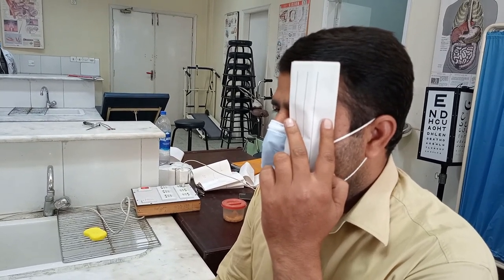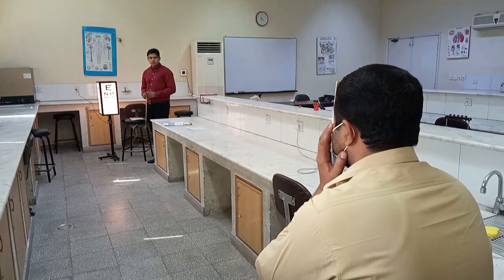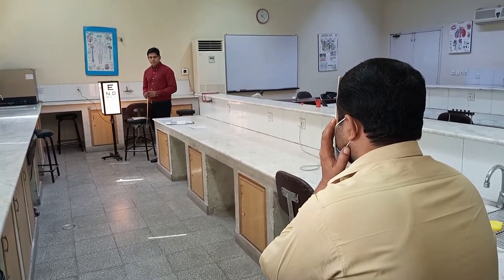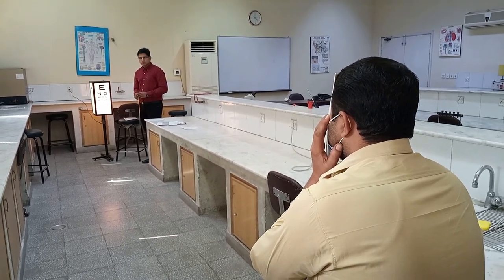You will ask the person to read from the top line and line by line, and you will note the last line he is able to read. You will see the number which is written next to the line.